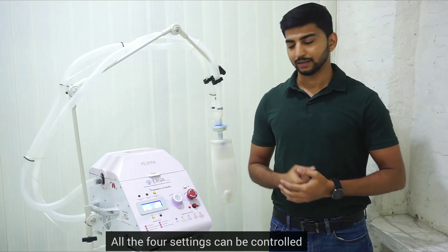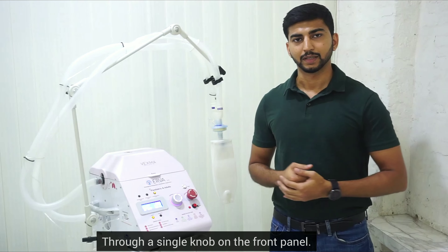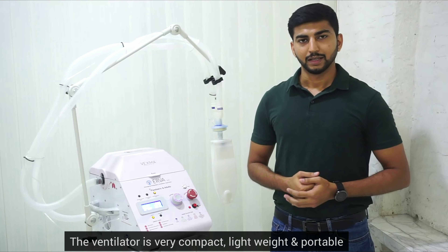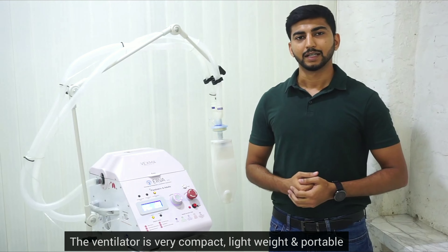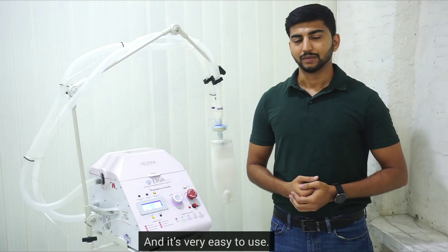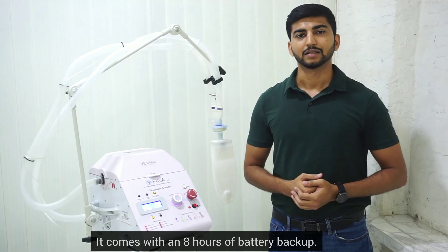All four settings can be controlled through a single knob on the front panel. The ventilator is very compact, lightweight and portable, and it is very easy to use. It comes with an eight-hour battery pack.